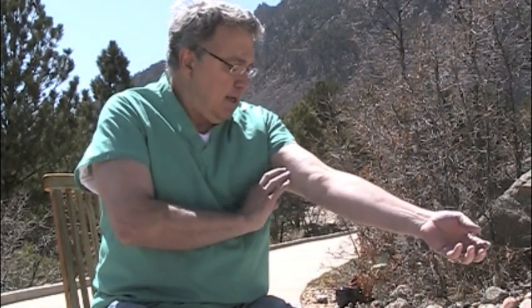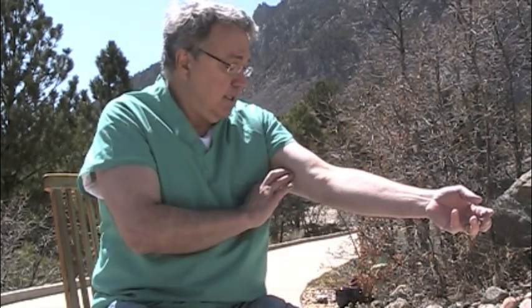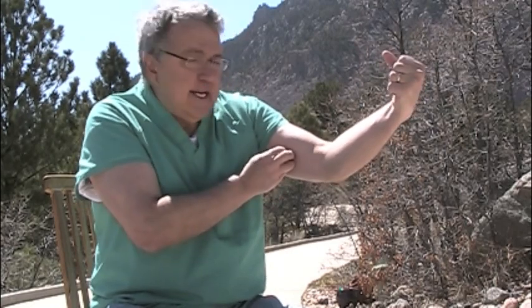The other thing is you know that the artery in the arm is going to be up here, and even if the bleeding is down here, you know this is where it starts. So if you put this tourniquet on, maybe either press in there or put a little extra padding on this side. Some people have big muscles and maybe that tourniquet is not going to get to the artery that way. So you put a little padding right in there, and then slip the tourniquet, tighten it, and it's more than likely going to work well.